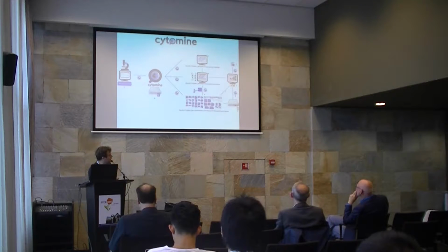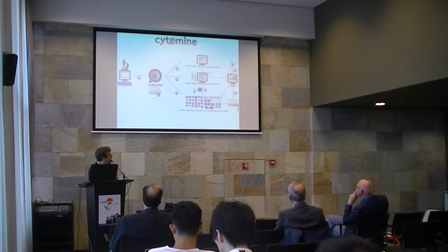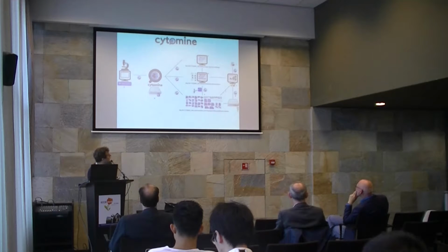For example, you can implement algorithms that will access this ground-truth data, run these algorithms on remote servers, and the result of this algorithm can be analyzed by experts through the web, so that finally they can export their data in standard format to exploit this. So that's really a simplified view of the software and how you can use it. You can have several database servers, you can have several computing servers, etc.